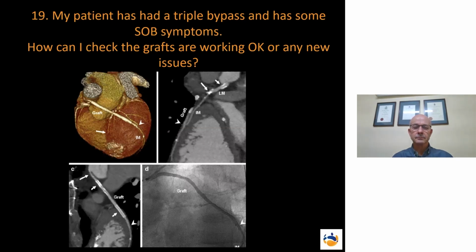coronary bypass grafts are not actually coronary arteries. They're not moving with the heart to the same extent. They're not as challenging to get good imaging as coronary arteries. And in fact, we get exquisite visualization of bypass grafts. We get very accurate assessment of when they've atretic and starting to go down, when they're occluded or partially filled.